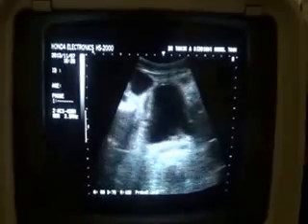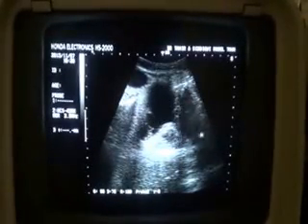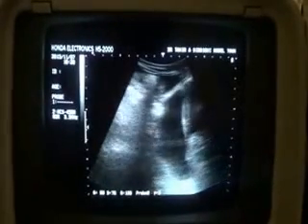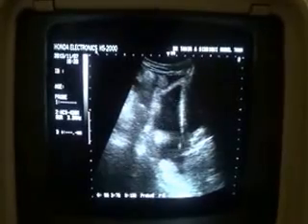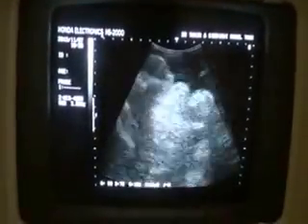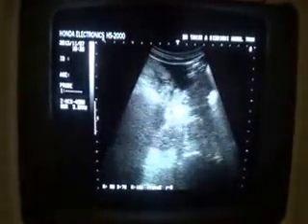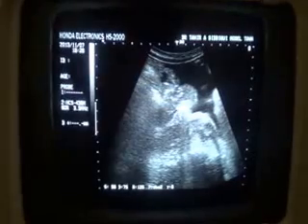This is the urinary bladder. This is the prostate. These are normal, and here you see the urinary bladder, the ascitic fluid, and the bowels. Again, when I go upwards, I see fluid in the right Morrison's pouch and right paracolic gutter.